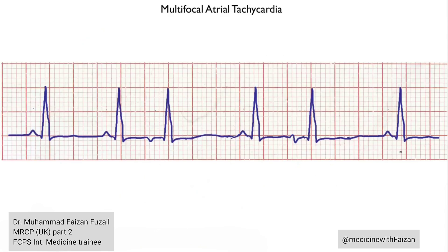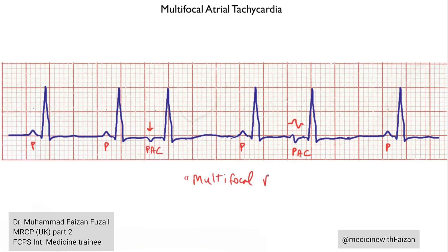Imagine you're looking at a rhythm strip like this. These look like normal sinus beats with p-waves and QRS complexes. This is clearly an early beat — a premature atrial contraction — followed by a compensatory pause, another sinus beat, and then another PAC. But the p-wave looks different: this one is a biphasic p-wave that goes up and then down, while this one only goes down. So what you have here is sinus rhythm with multifocal PACs, which is different from multifocal atrial tachycardia.